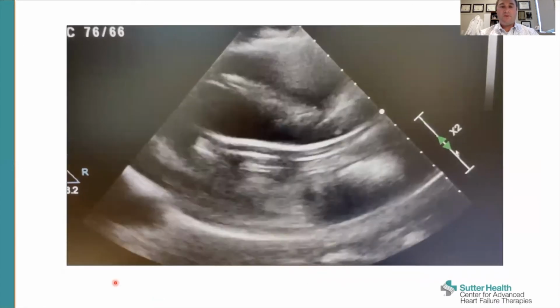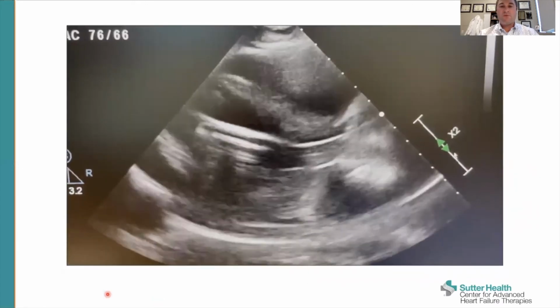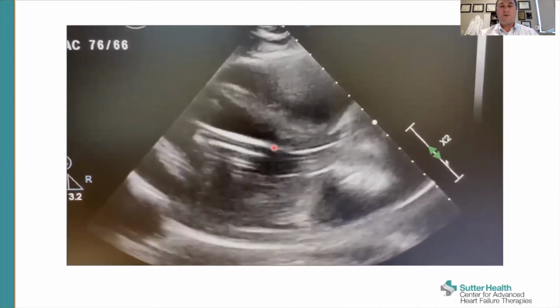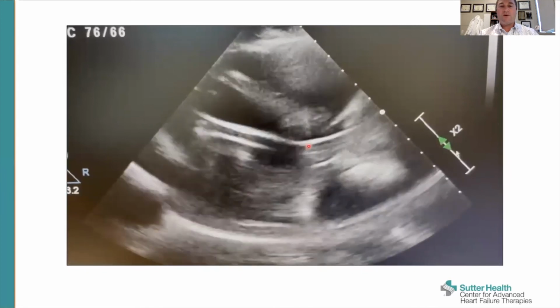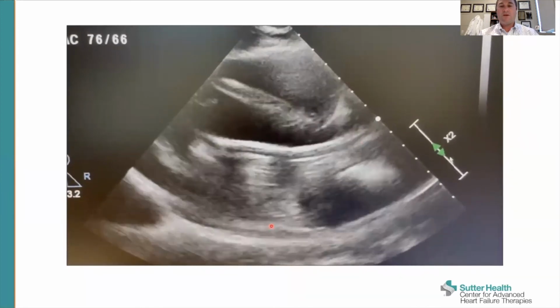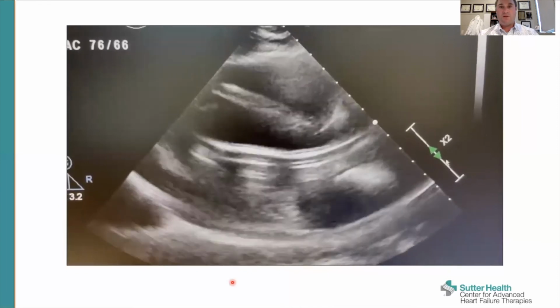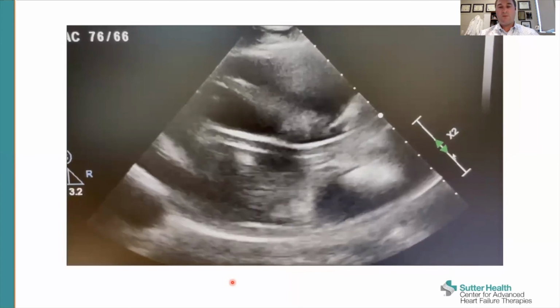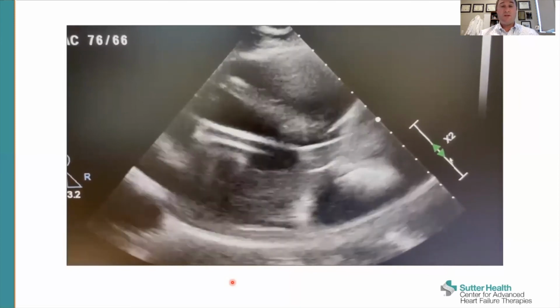Here's an example in real life of a patient whose pump is in too far. So we see this is the distal inlet area. Here's the pump housing. And then this is the bend part here. Now the aortic valve is in this area. So this patient's pump is too distal in this particular scenario, and this pump was pulled back. And whenever you're adjusting an Impella position, you should always reduce the pump speed to P2.